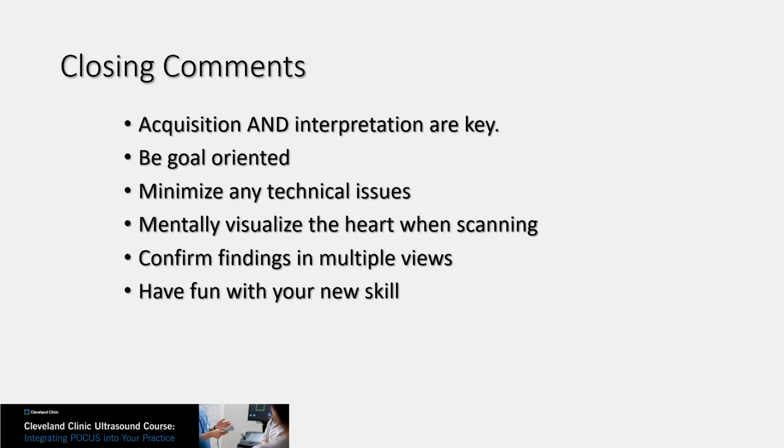Again, closing comments: acquisition and interpretation are key. Be very goal oriented, try to figure out what you are trying to ask when you're performing the cardiac ultrasound. Try to overcome the technical issues, use gel, use the right probe, try to get them in left lateral decubitus position. Very, very important, mentally visualize the heart. Confirm the findings that you are seeing in multiple views and have fun with your new skill.